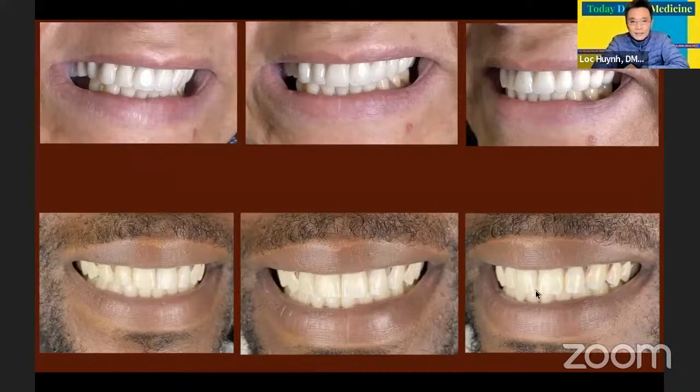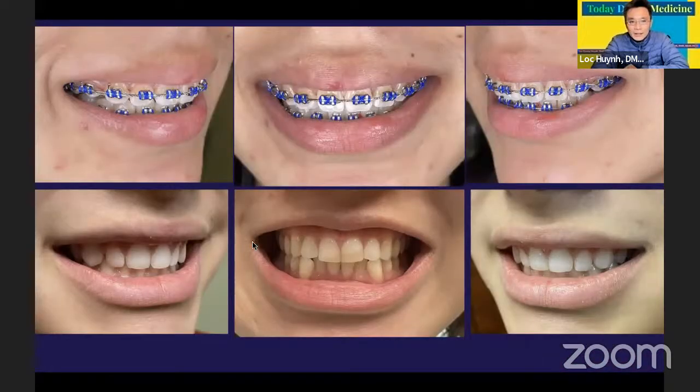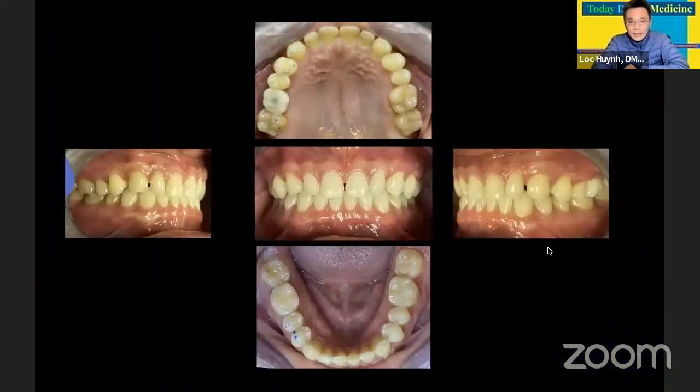That's the second round. Again, the trick is you have to get enough light. The more light you have, the better it looks. Same thing here, more light gives you more detail. I didn't use anything besides the iPhone. Here we didn't use enough light, so it looks darker.